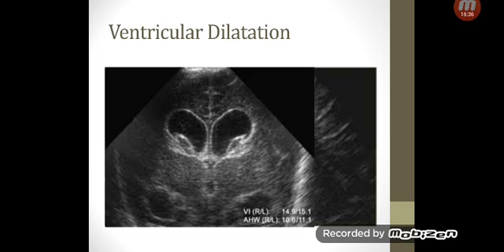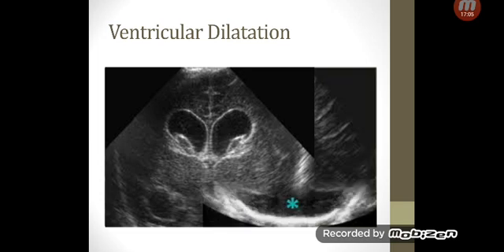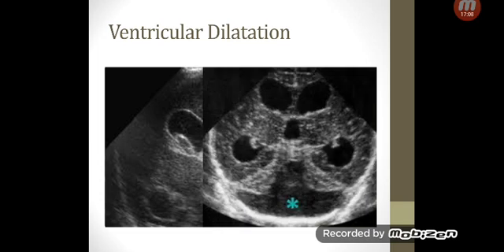So you can appreciate here that actually the lateral ventricles, both of them, are really dilated to the point that even here, the posterior horns have come into the field again because of how dilated they are. Because if you think about the ventricles looping around, coming back here with their tails, the tails are dilated to the point that they're all showing in the same field here, really big. This is a good picture, I think.